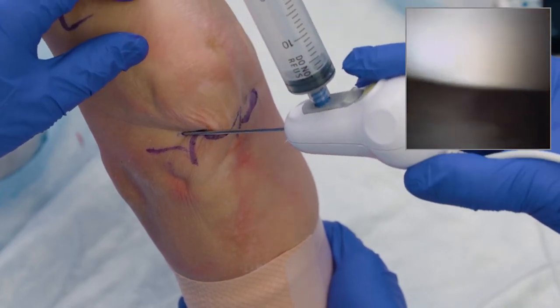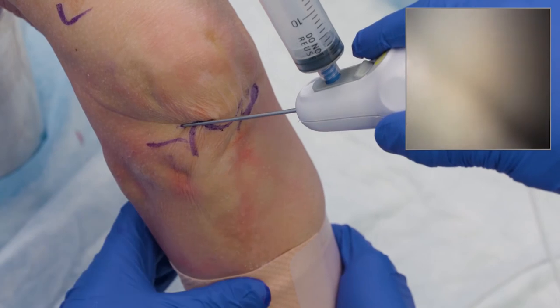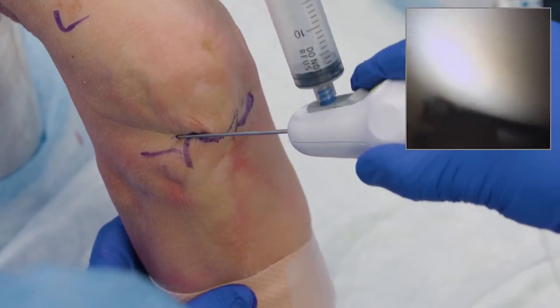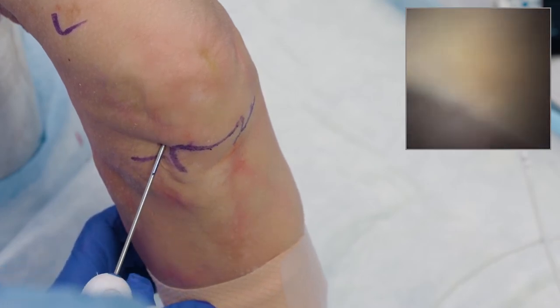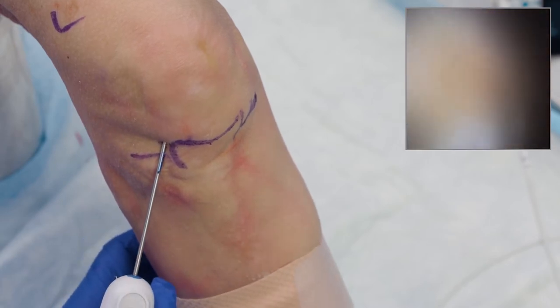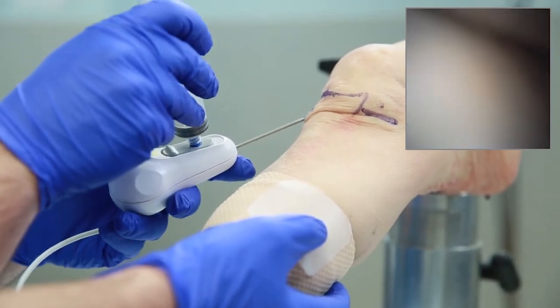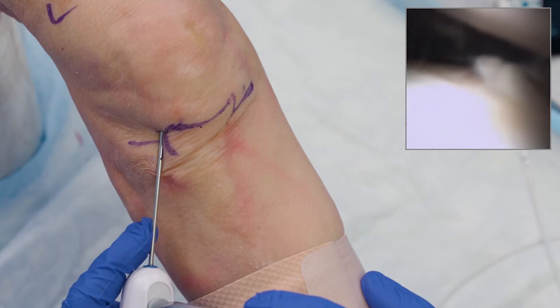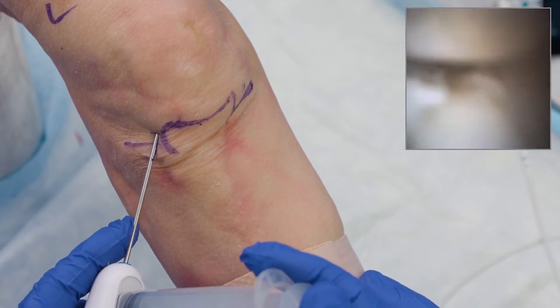I'll drop my hand back down to neutral and retract back a little to get into the lateral gutter. There's some synovium in the lateral gutter, but it allows me to get up in there and view. If I then drop my hand and swing up toward the patella, I'm able to get into the patellofemoral joint area. Being careful not to over-inflate the fat pad keeps it out of my way. I can extend the leg while dropping my hand down toward the floor, which allows me to view my trochlea as well as my patella. There's my patella in the superior portion of the picture, and swinging down shows a little bit of cartilage change on the trochlea.